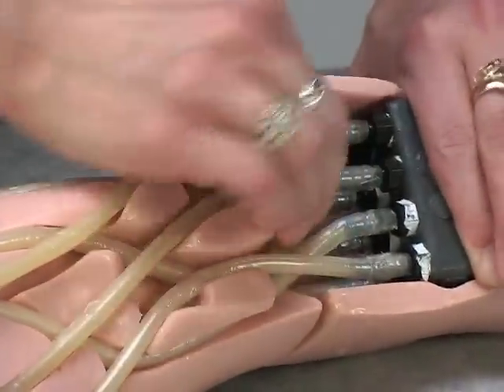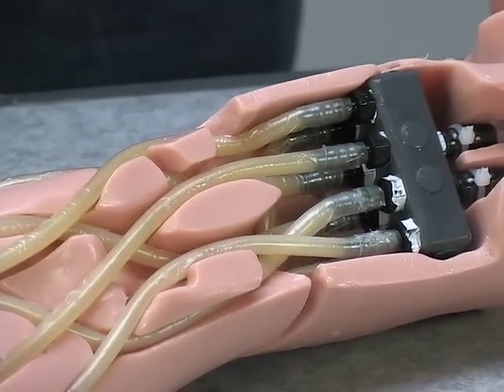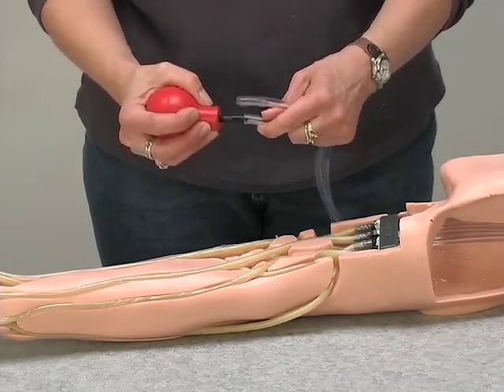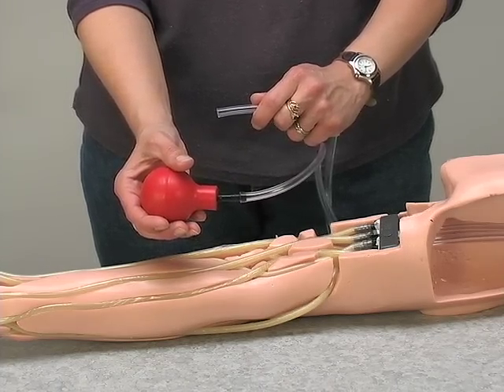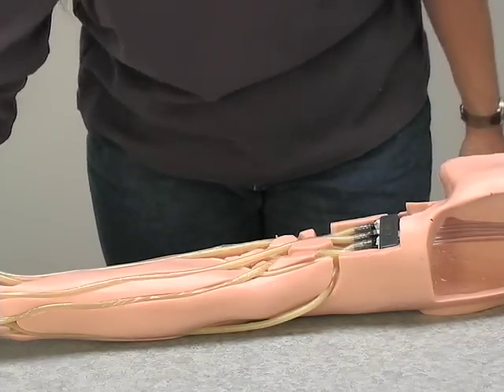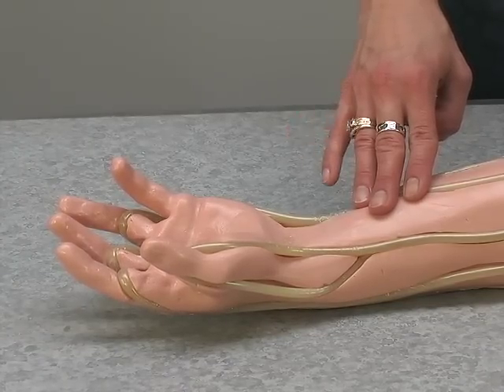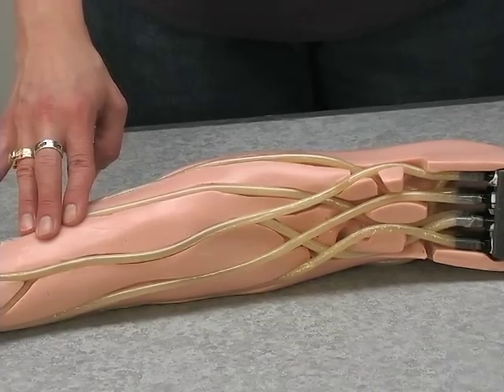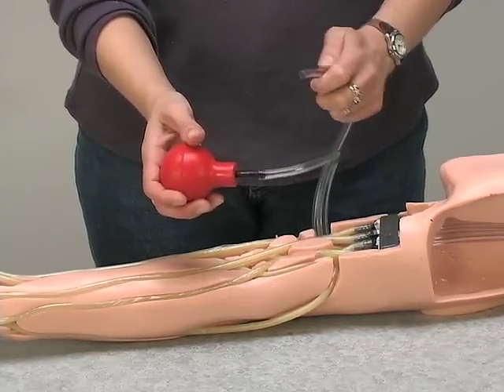Check that all fitting connections are tight to prevent leakage. Next, check to ensure proper flow through the arm by taking the clear inlet-outlet tubing coming out of the shoulder. Either blow or pump air into one tube and feel the flow from the other side — this ensures the arm veins are free of obstructions or pinches. If you cannot feel the flow, check for pinching of the tubes around the fingers and in the arm channels. Note that the air bulb is not included in the kit; either use your own or blow into the tube with your mouth.